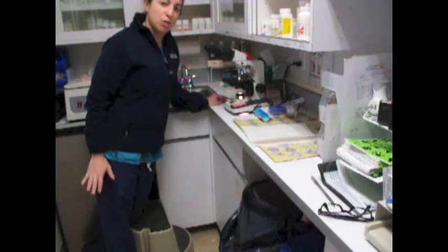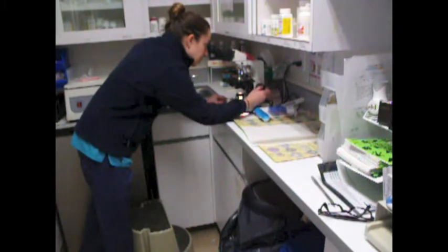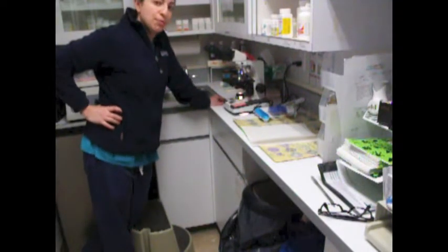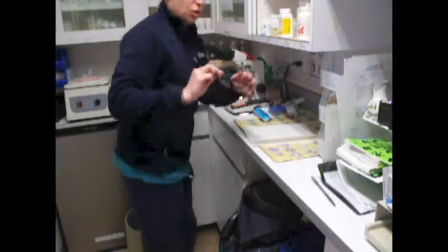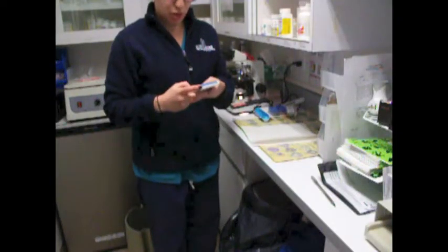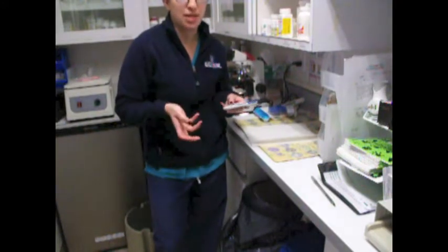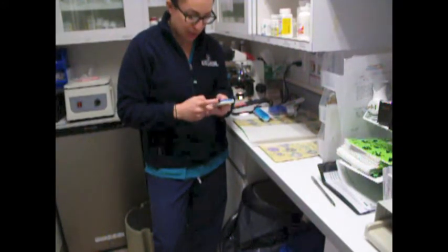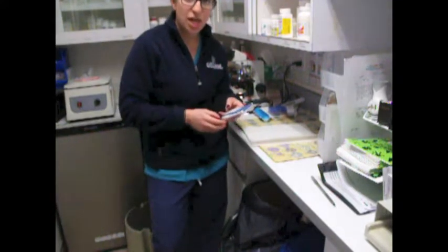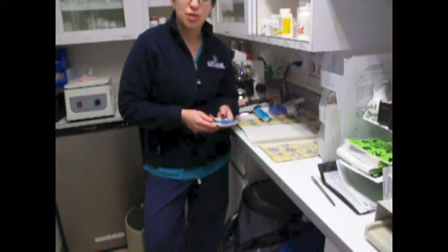So I'm now performing my platelet estimate. I'm counting the number of platelets per high-powered field. So I have seen about 15 platelets per high-powered field. Sometimes it ranges up to 20, but it's about 15. So in order to do my platelet estimate, I'm just going to get my calculator. I'm going to do 15, which is how many I saw per high-powered field, times about 15 to 20,000. So just say do 15 times 20,000, and I get 300,000 platelets per microliter of blood. So that would be my platelet estimate for this microscopic blood film.